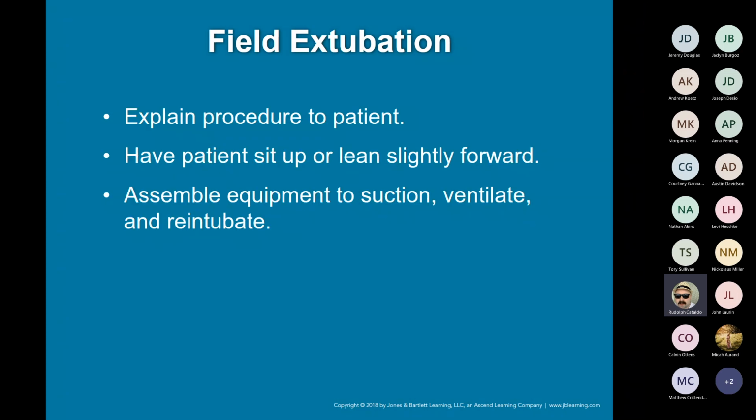In this instance, they're saying explain the procedure to the patient. I'm guessing the patient was in some sort of sedation and started to come to, so they were telling the patient what they're going to do. And you'll actually see that even post-op, they'll let the patients come out of sedation. They want to make sure they can breathe on their own before they remove the tube. They won't remove the tube and then bring them out of sedation. They'll bring them out of sedation, then remove the tube.